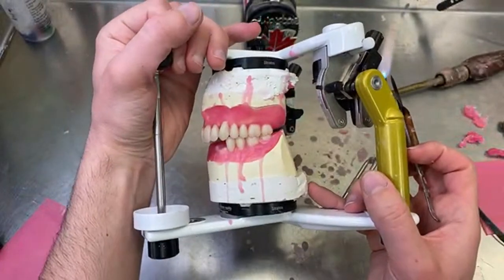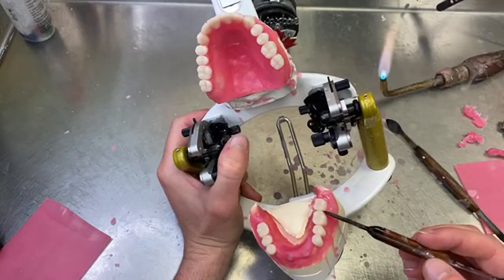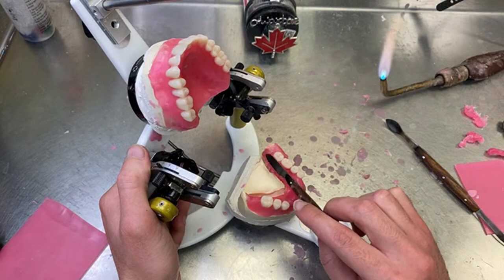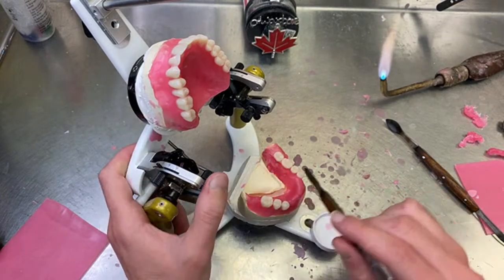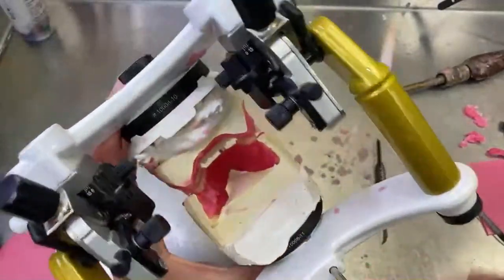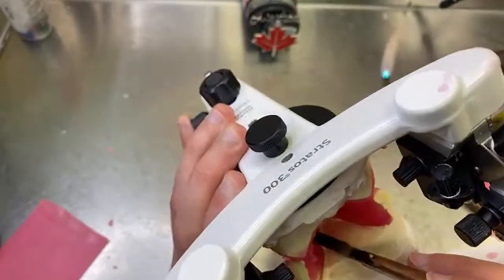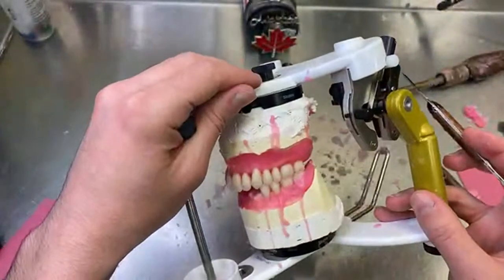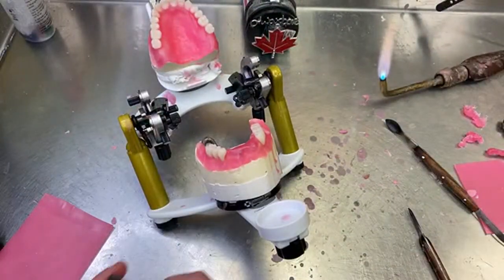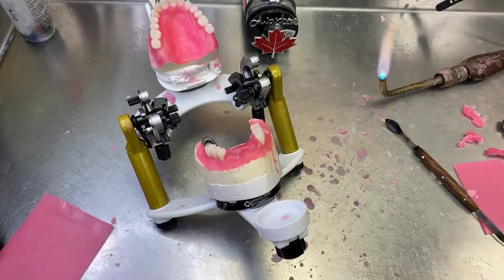See that curve? Whew, that worked beautifully. You'll notice that when you set that last premolar here, last molar, you will have a little bit of kind of like tilt, which works perfectly on a balanced occlusion with these type of teeth. So I'm not talking about whole teeth, because some things work differently than other things. And the last one here. Tooth is stuck in the card.